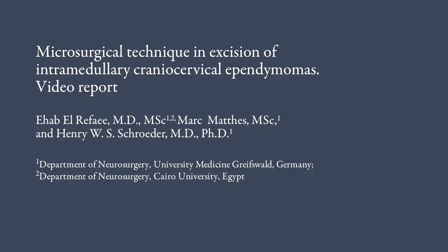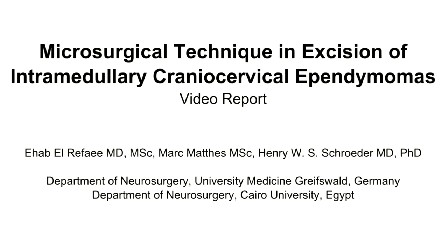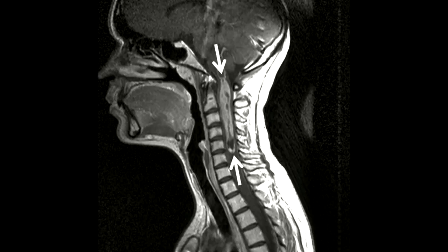This video is to demonstrate the microsurgical technique in excision of intramedullary craniocervical ependymomas. As we can see in this preoperative MRI of a 27-year-old female, who came complaining of neck pain and bilateral arm pain and paresthesia, showing an intramedullary tumor from the level of the foramen magnum to the level of C5-6 vertebrae.